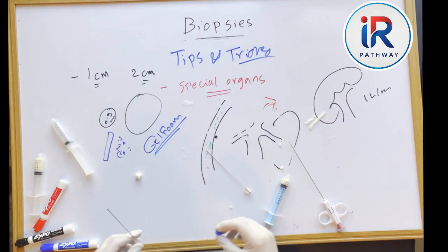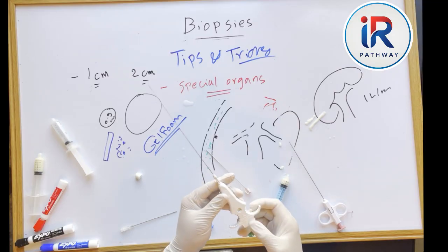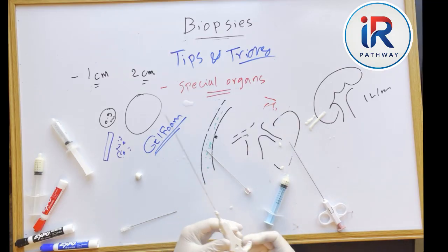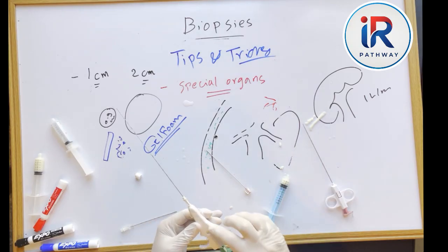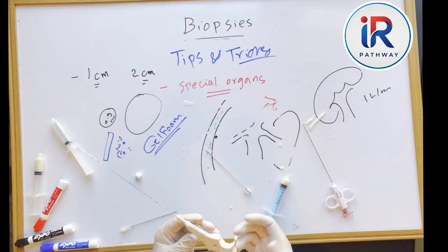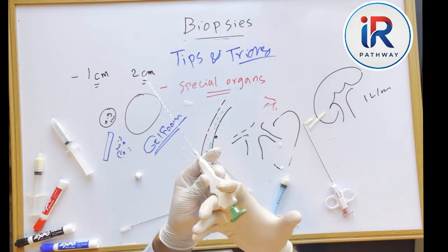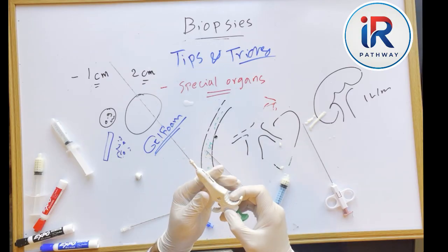So, are there any other modifications? Yes, there are newer biopsy needles available, like the one I'm about to show you. Okay, here this needle is from Argon Company. It's called the Supercore Advantage, the older model called Supercore. The Supercore Advantage applies the same concept but in a more fancy way. The design is slightly different to improve ergonomics and make sampling easier.